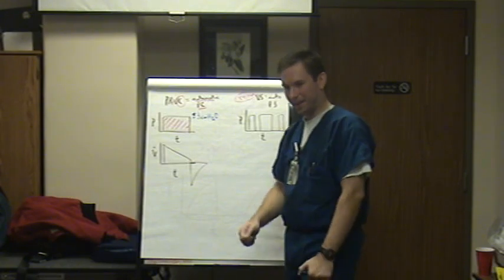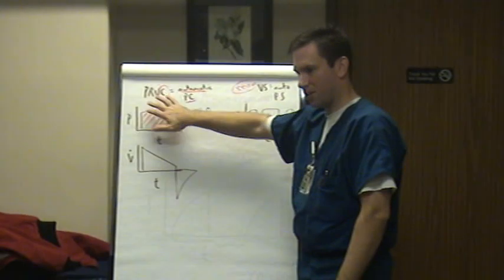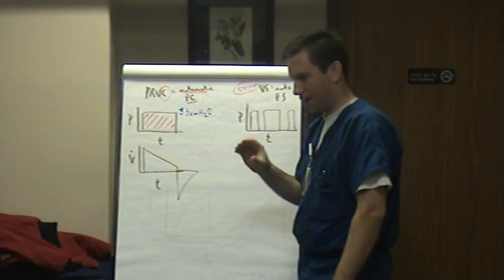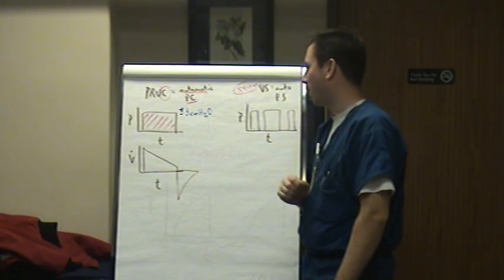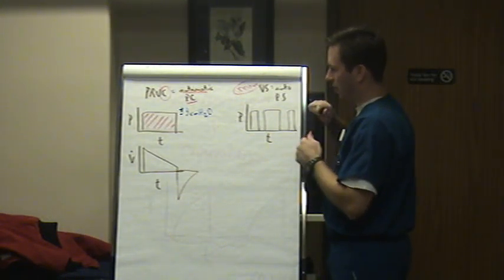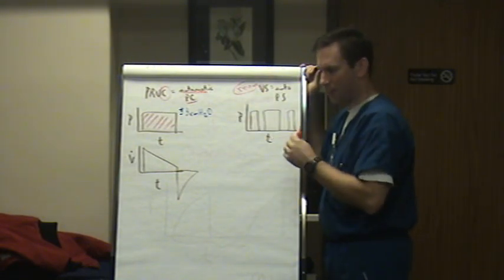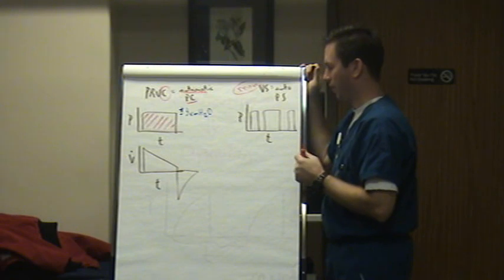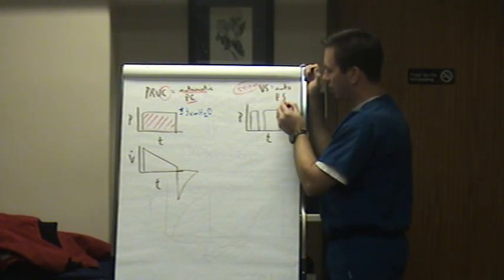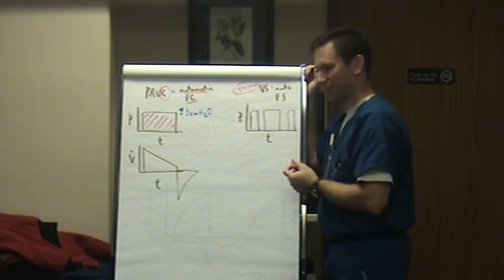Well, he wasn't here then, but we would go up and down on the pressure support to do the same thing as I talked about earlier, to keep that patient's spontaneous breaths in a range that kept them from wearing out. Volume support fixed that problem for us as well. We can now dial in 350 or 400, wherever that point is that we think is enough support for them, that they don't wear out. And when the patient starts the breath, it's going to go up and down on the pressure support to give them that size tidal volume.